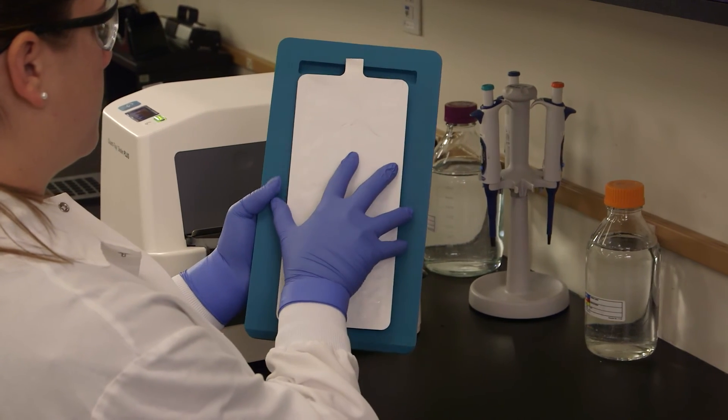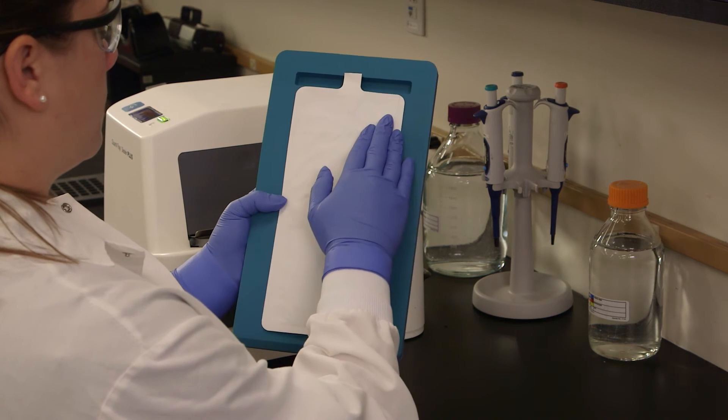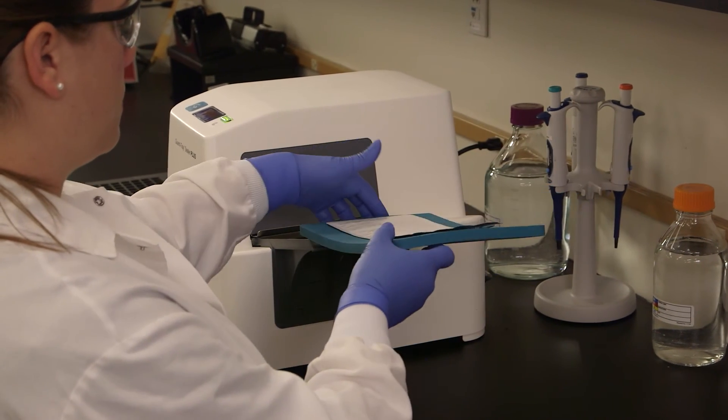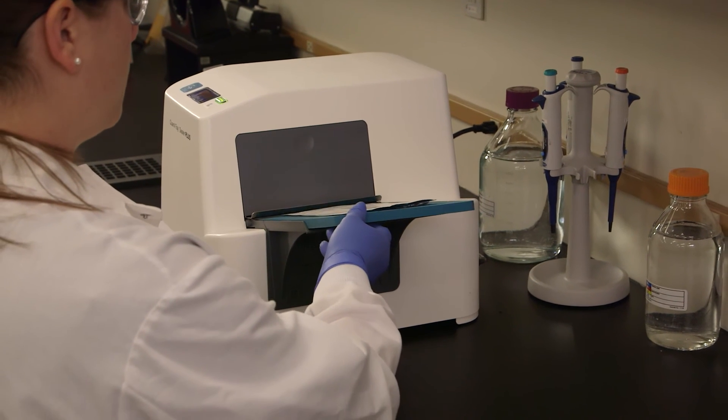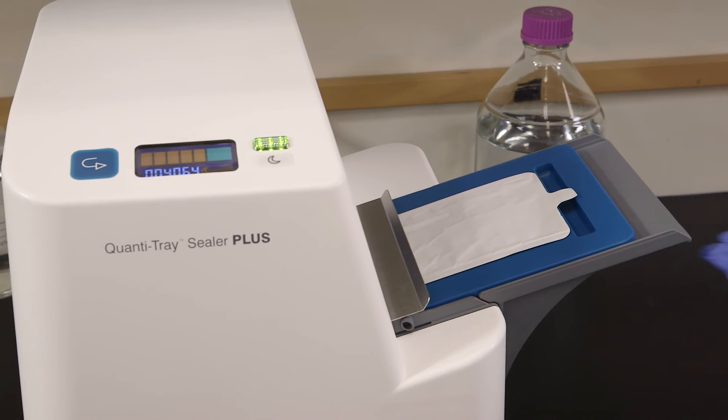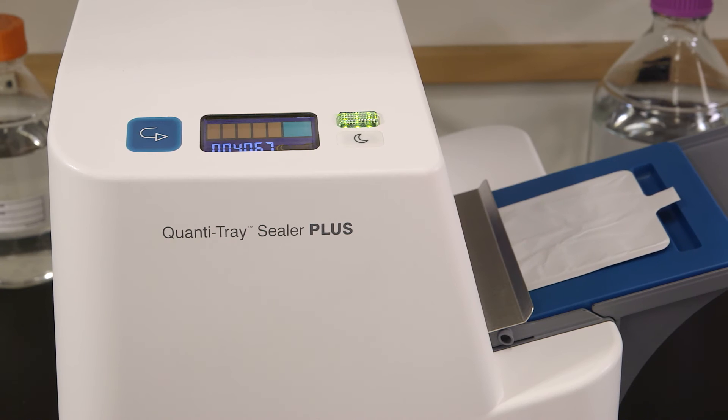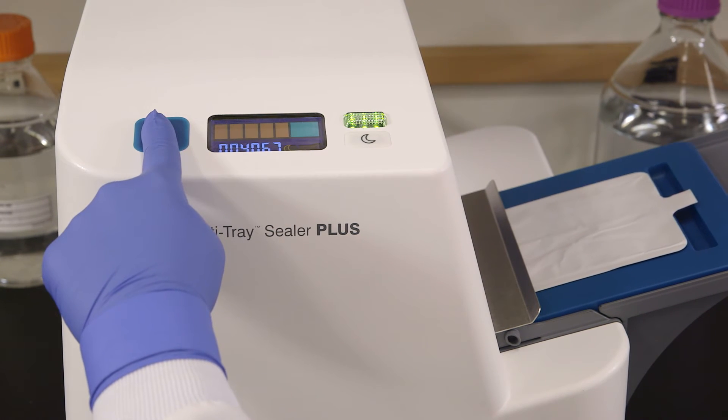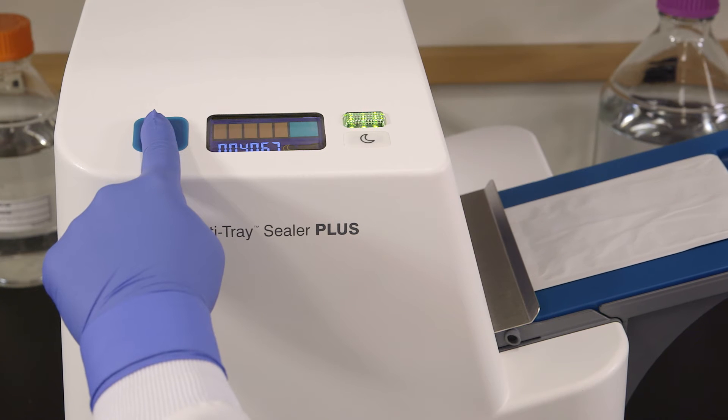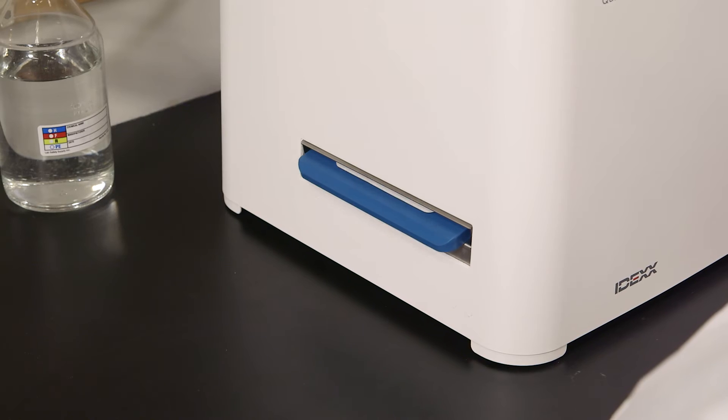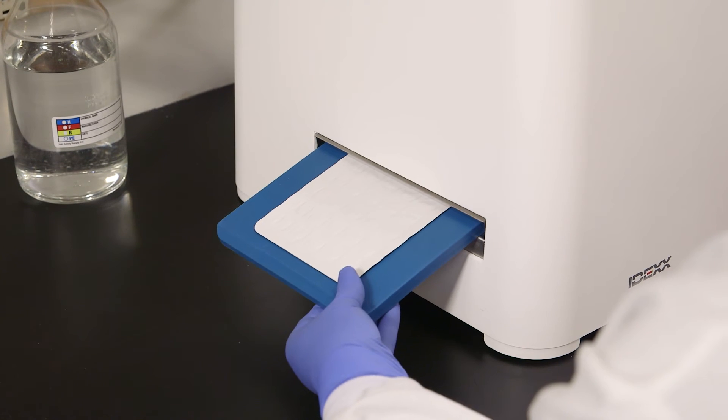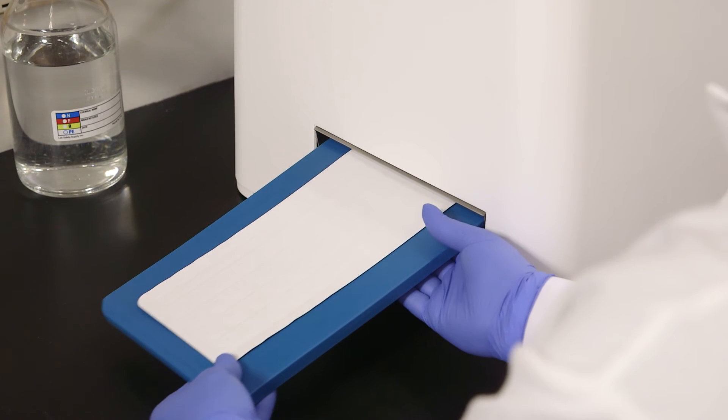Place the filled Quantitray on the rubber insert, making sure each well fits its corresponding hole. Push the insert with tray into the sealer until the sealer grabs the tray and pulls it into the slot. If you need to reverse the motor, press and hold the reverse button. However, do not reverse the motor if the rubber insert is completely inside the sealer. The sealer distributes the sample mixture into the Quantitray wells, seals the wells, and partially ejects the sealed tray.